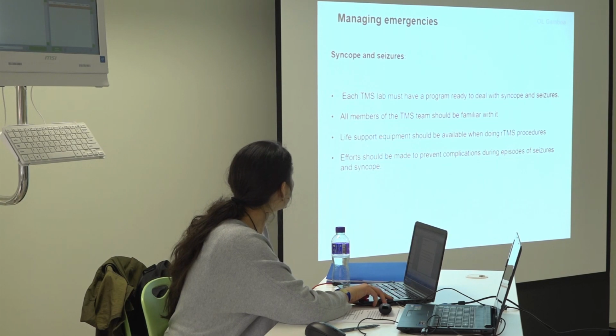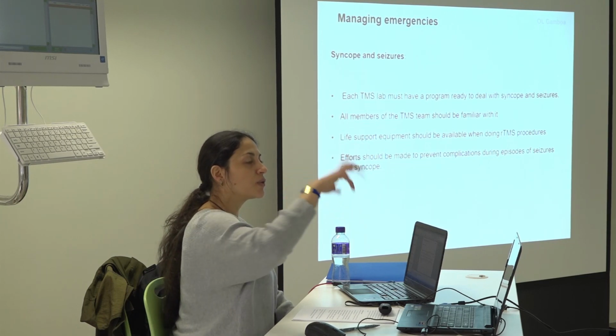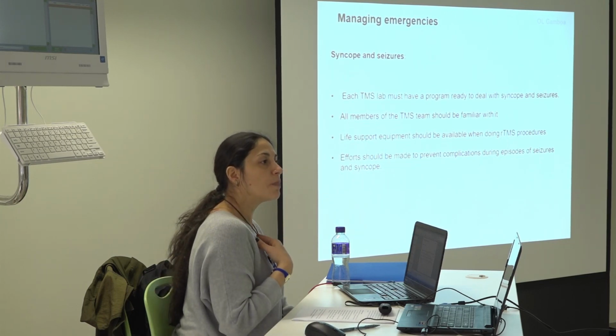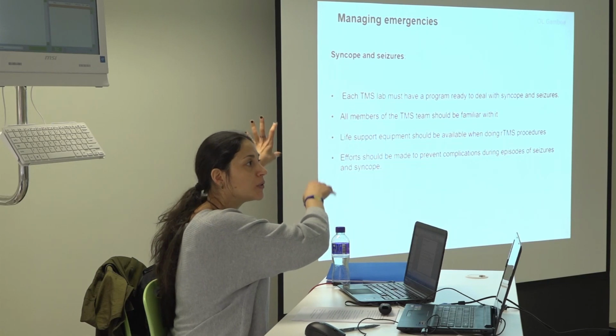So, managing emergencies. Each TMS lab must have a program ready to deal with syncopes and seizures, compulsory. That is a must. When people start TMS, they need to have training about that. After this workshop, I recommend that you bring someone who gives a workshop. It will take probably just 1 day, and they will teach you what to do in these cases as an expert, how to handle the situations, and show you the different types of seizures and all this kind of stuff.